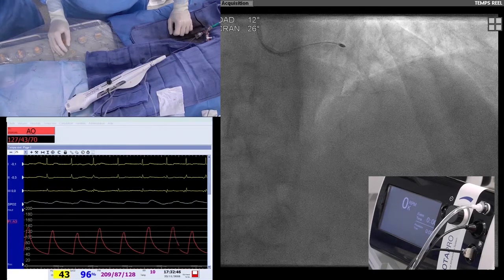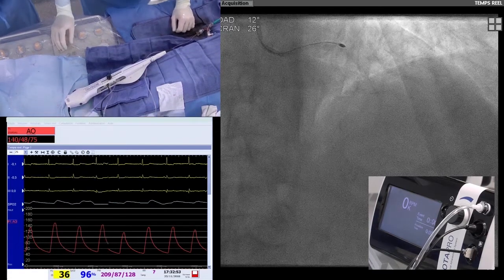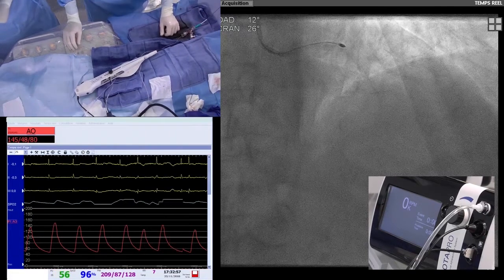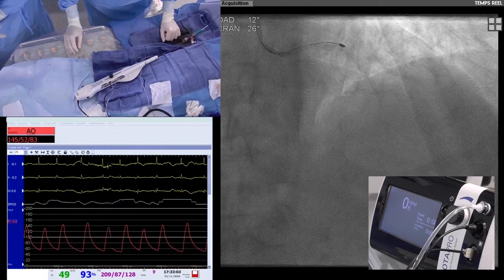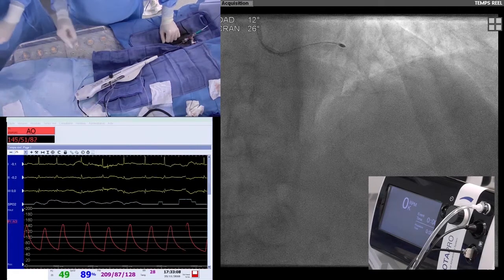It was an empty arrow, which tells us that the speed has gone down around 5,000 RPM, more or less. When the arrow is full, then it means 10,000 RPM. So this is a warning sign for us that we might have too much deceleration there. And this, of course, we know might be portending complications.